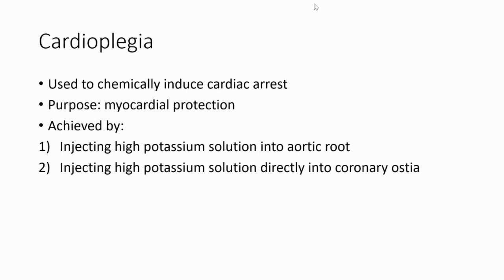Now, retrograde cardioplegia is where instead of delivering cardioplegia via the arterial system, we deliver cardioplegia via the venous system. So instead of delivering it to the left and right coronary ostia, we would create a small opening around the coronary sinus, which sits around the back of the heart, and place a cannula there. And we would give the cardioplegia solution this way.